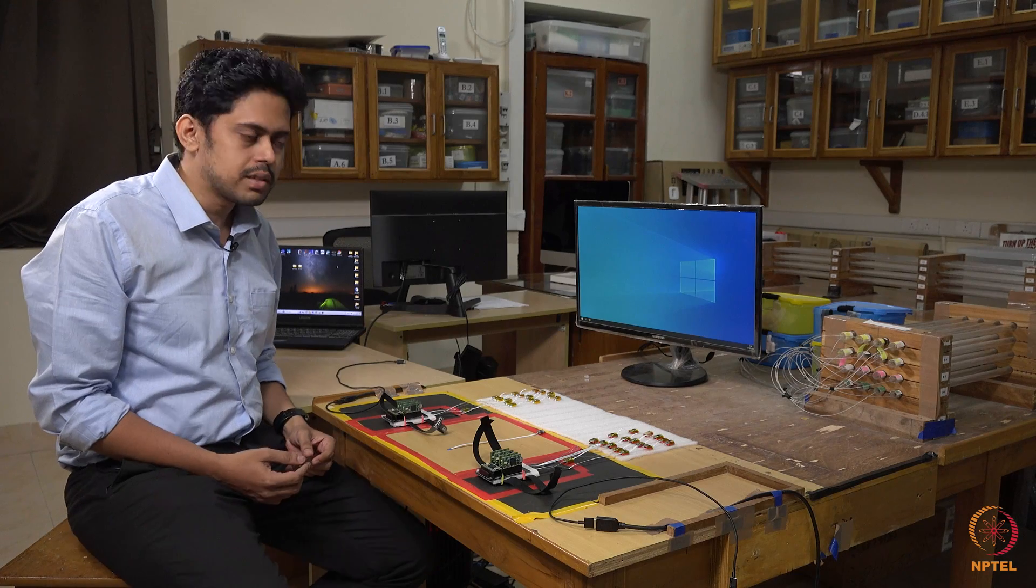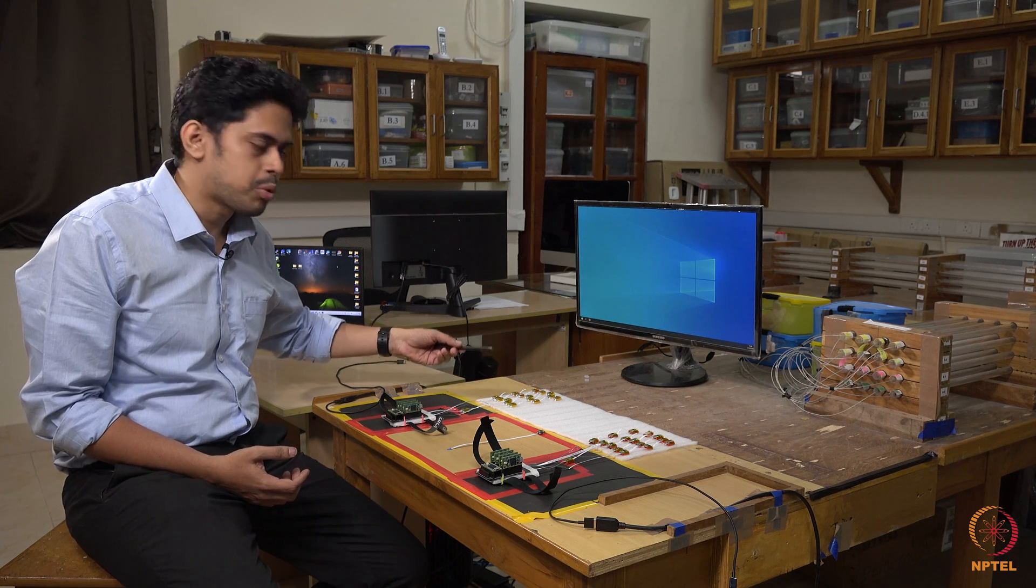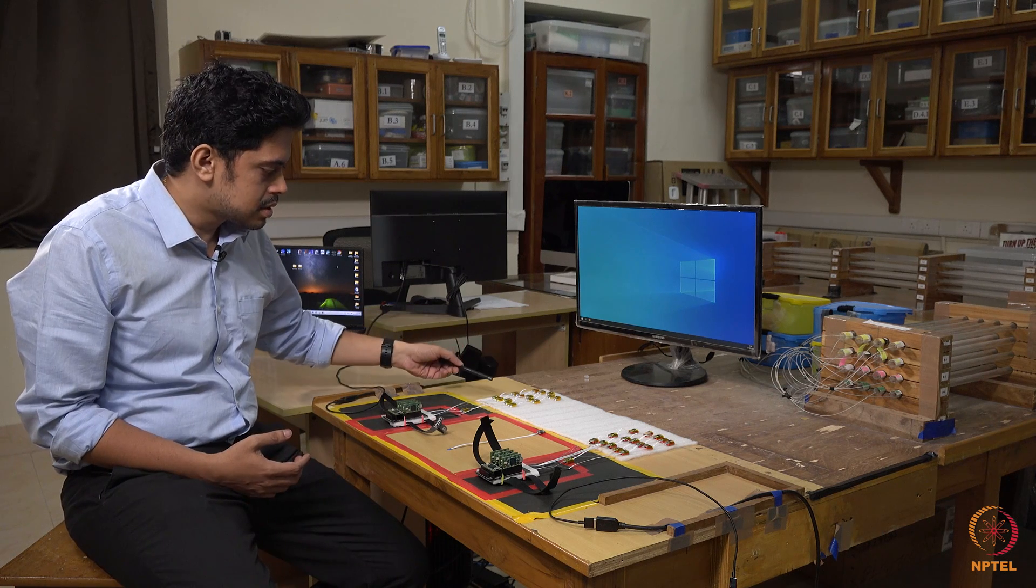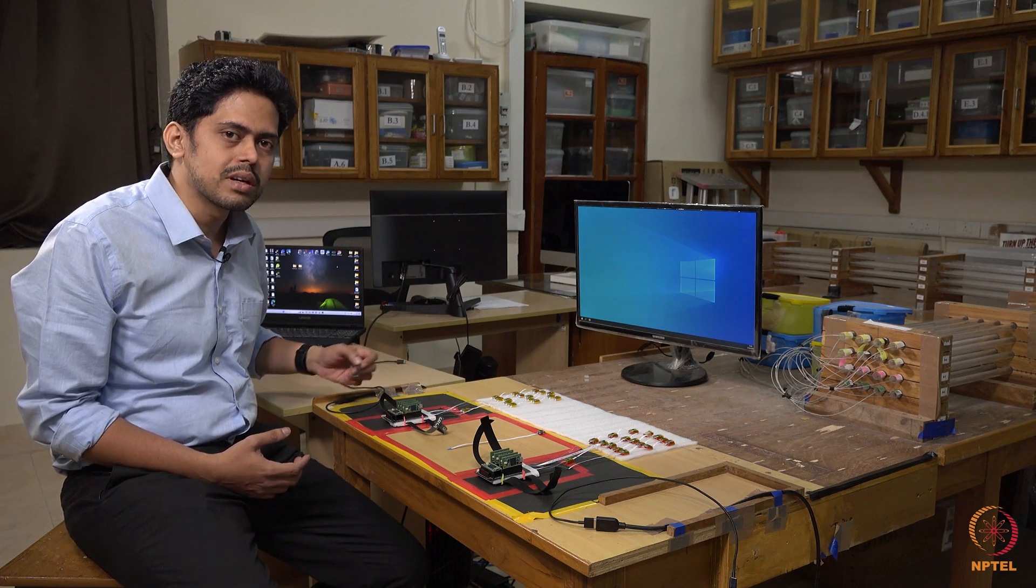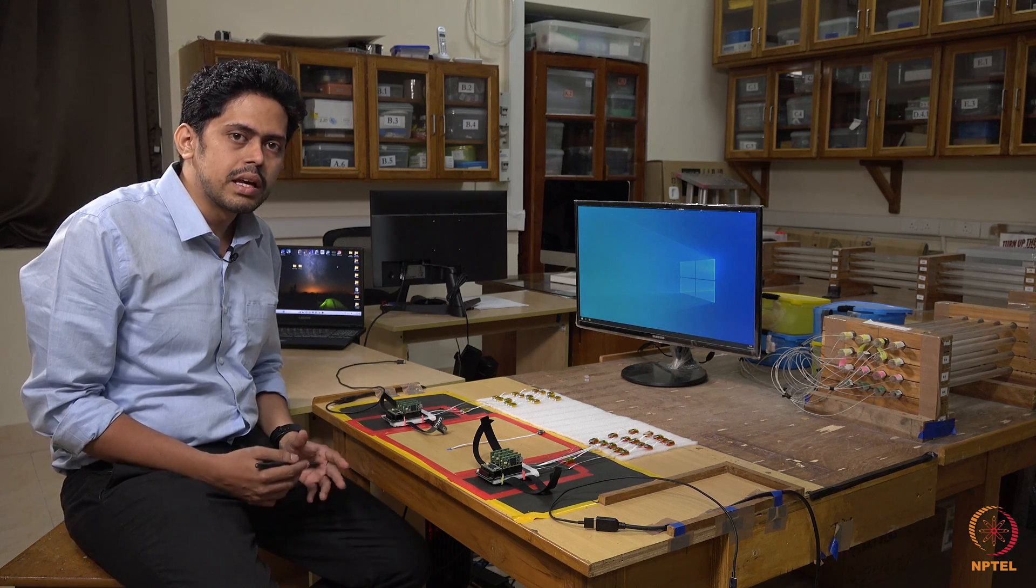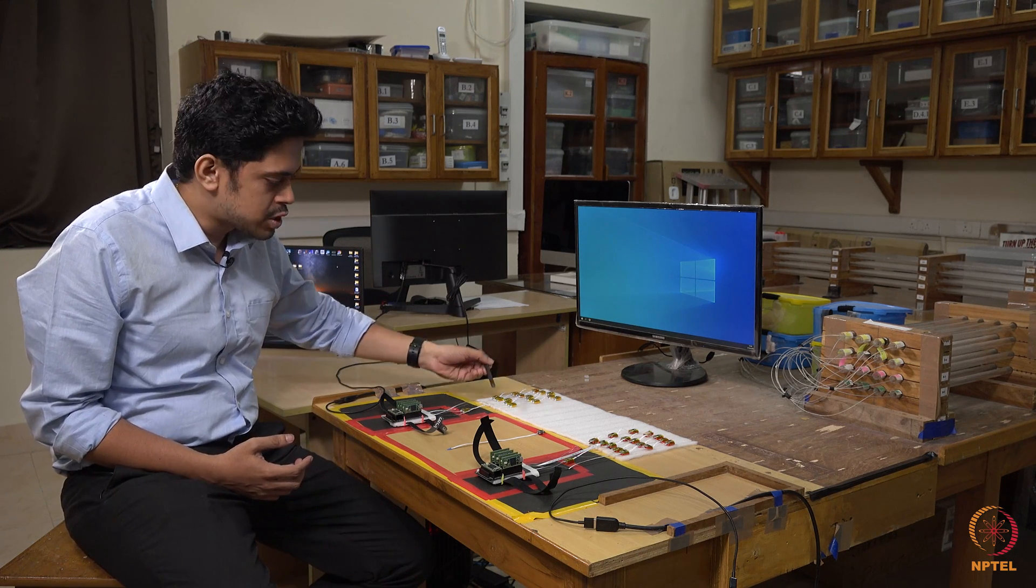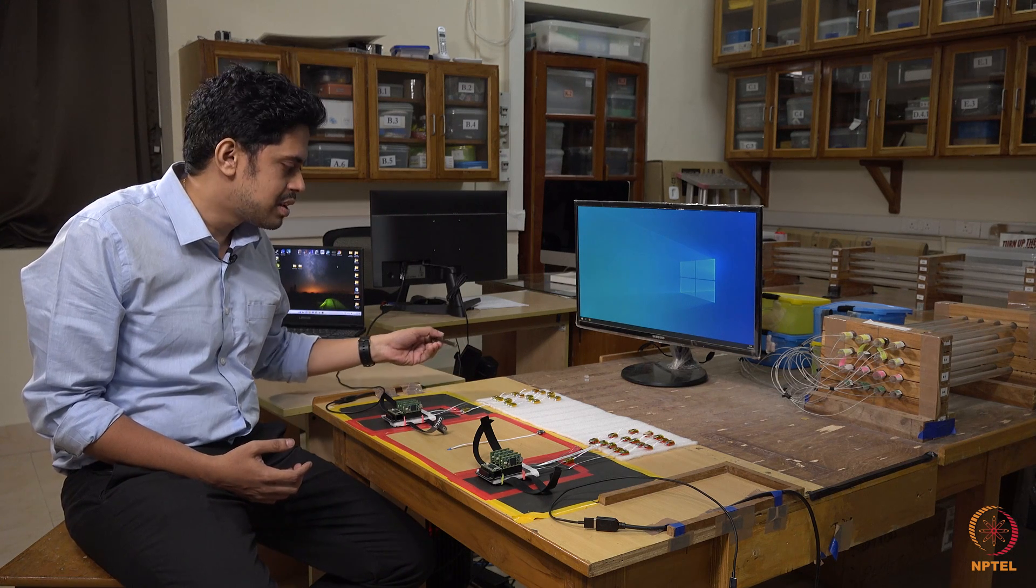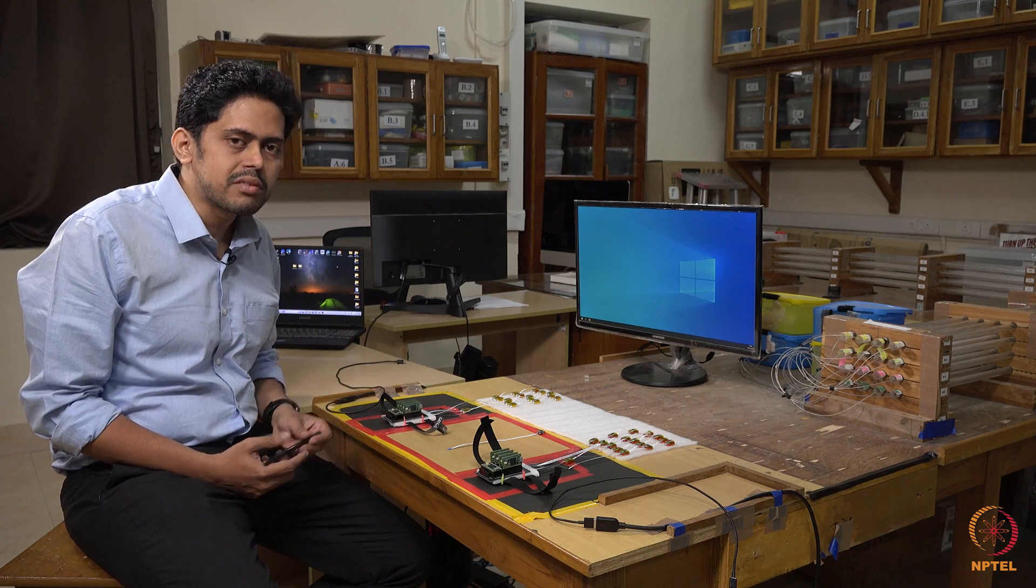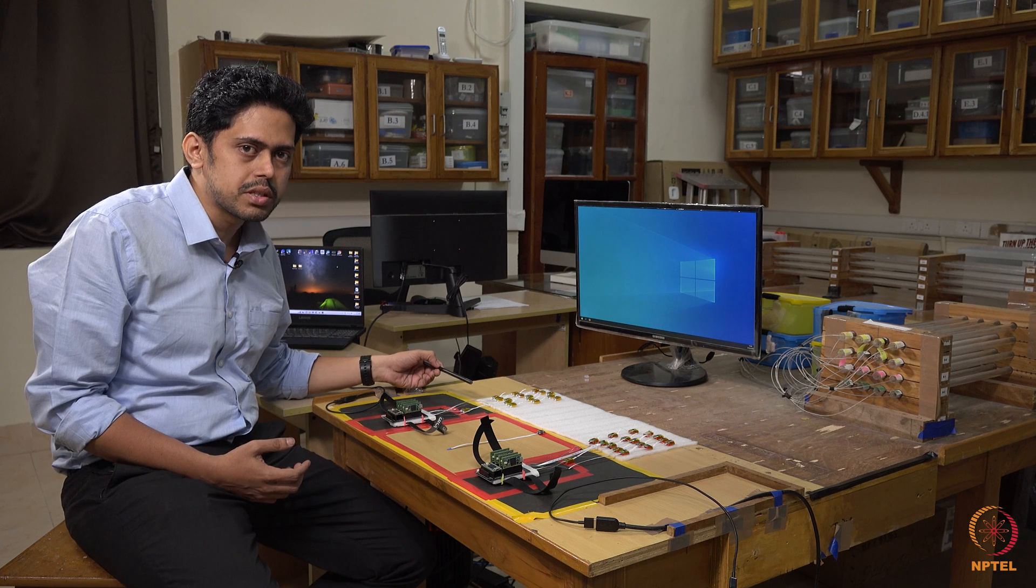This is the device which consists of 16 sensors and these sensors will be attached to the appropriate positions on the phalanges of the fingers and on the wrist. All these sensors are connected to the main receiving board consisting of 5 microcontrollers. This device is capable of generating data at the rate of 100 hertz. You can see each sensor is connected to each other as well as to the main board with the help of flexible cables also called FFC cables. These cables are very rugged and they won't snap during the operation or during the data collection process.